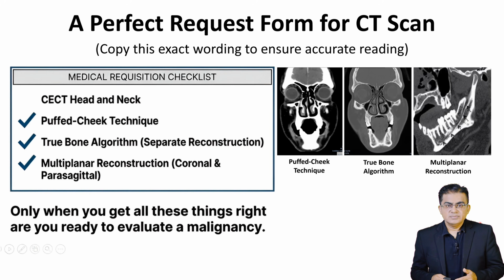Look at the screen. I call this a perfect request form for a CT scan of head and neck. I highly recommend you copy this exact wording to ensure we get an accurate and complete reading for your patient. First, you will ask for a contrast enhanced CT of the head and neck.